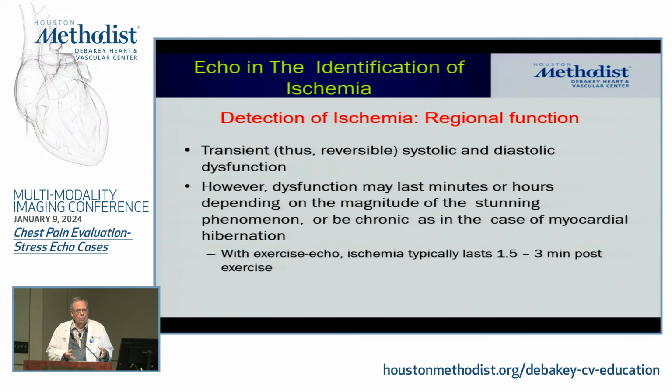So one of the principles of stress echo when it's done on a treadmill is you really want to acquire your images, if possible, within 60 seconds, certainly not much more than 90, because the longer it takes for you to acquire, the greater the chance that the wall motion may start restoring back to normal. And that's why stress echo as a technique for a sonographer is relatively intensive, and usually you don't start your beginner rookies doing treadmill stress echoes, because it does take a little while to become an expert in doing this.